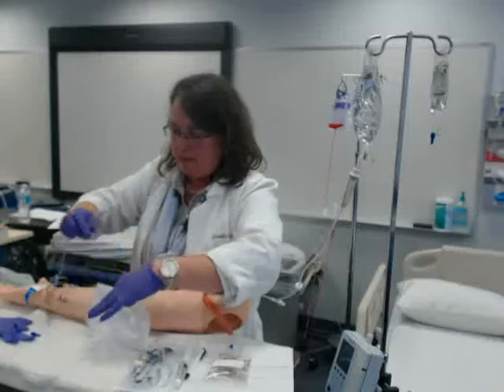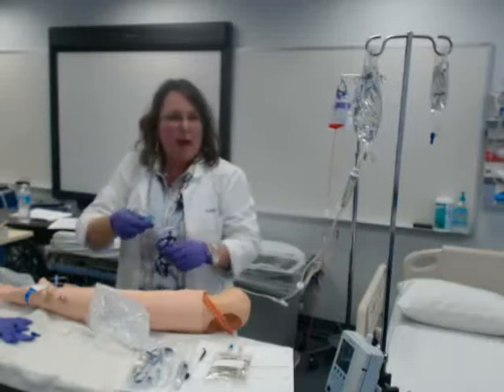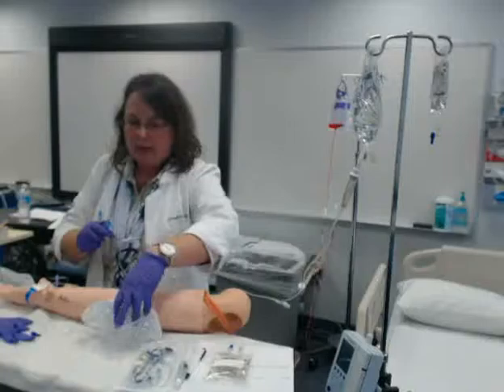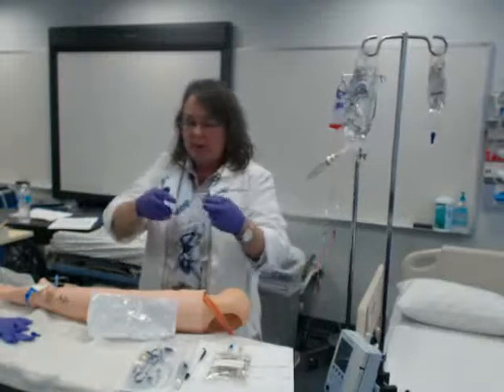I need to fill my drip chamber, alright? And there is a line here. So you fill it about a half to a third of the way full. And that's very important so you don't get air in your tubing. One squeeze — I'm going to get a little extra squeeze. So I filled my drip chamber.